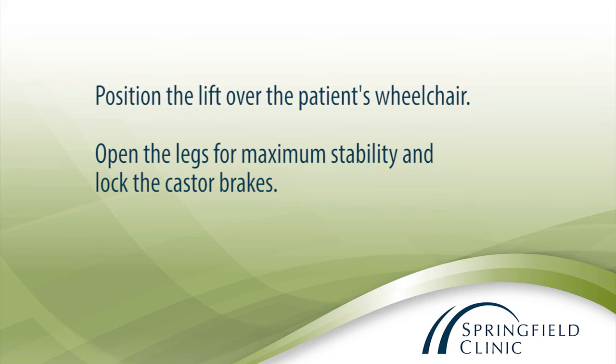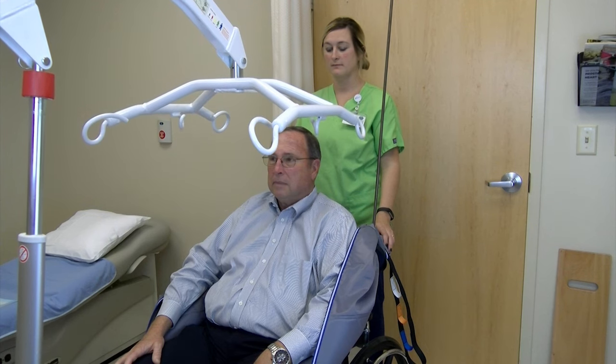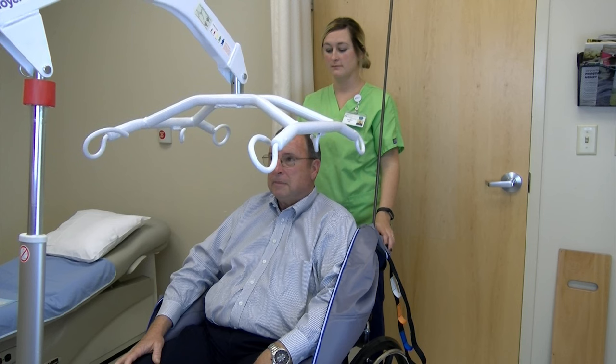Position the lift over the patient's wheelchair. Open the legs for maximum stability and lock the caster brakes. Lower the boom and position it so that the sling bar is parallel to the patient's shoulders.